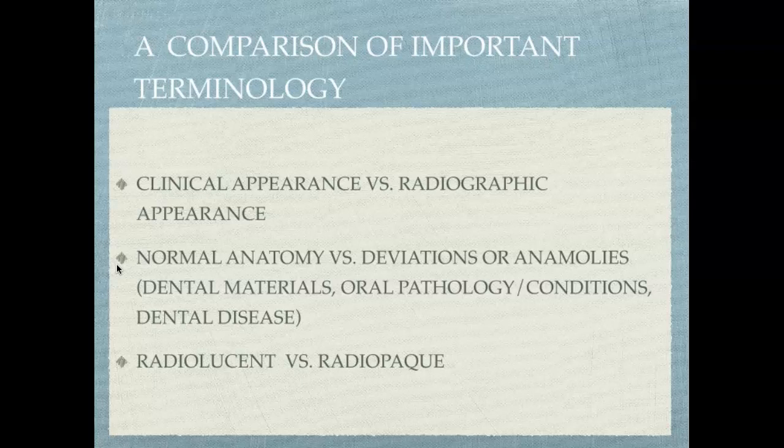Maybe the doctor wants to know, hey, what's going on, in a very casual manner, and so you are able to identify some dental anomalies or deviations.